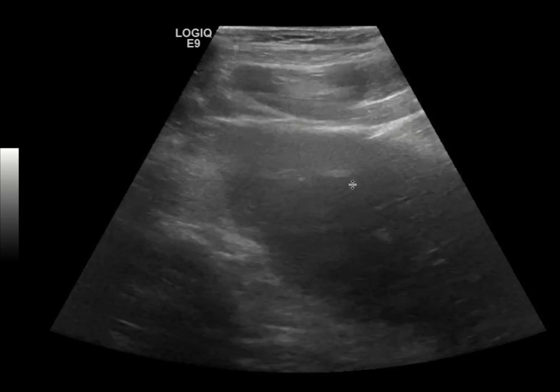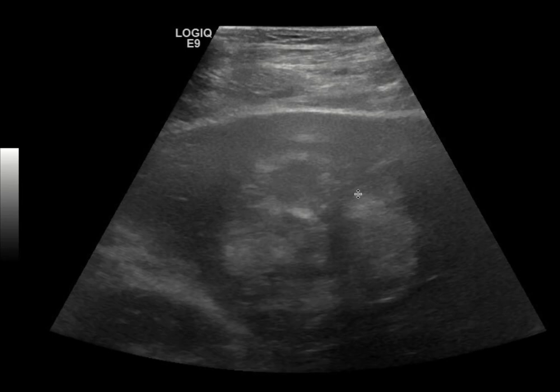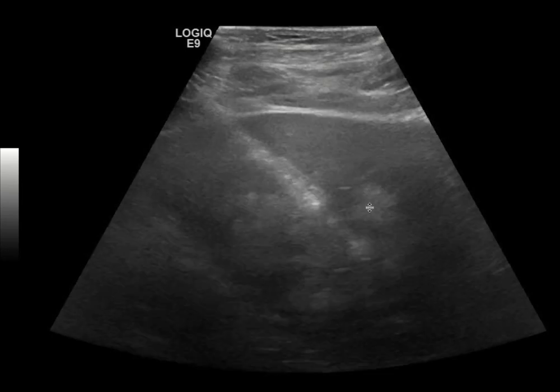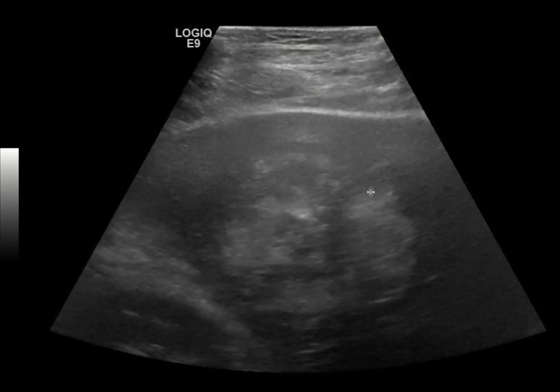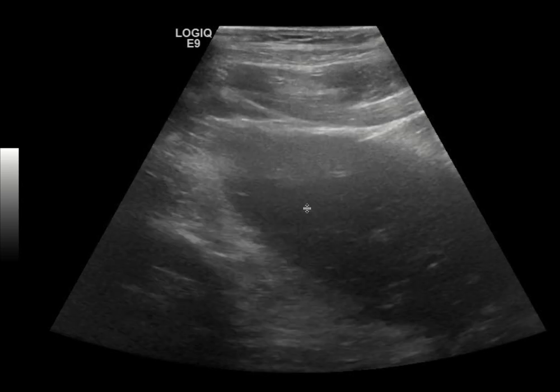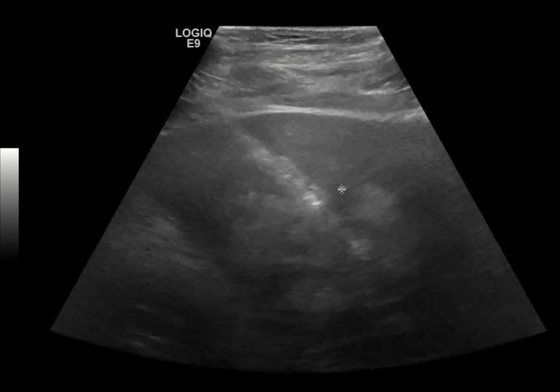And here we can see the biopsy that was done. This lesion looks quite echogenic, and abscesses can actually look echogenic in certain phases of the abscess formation. A biopsy was performed here that went right through the echogenic areas, and so this just came back as necrotic tissue, and so there was a request done for a repeat biopsy.